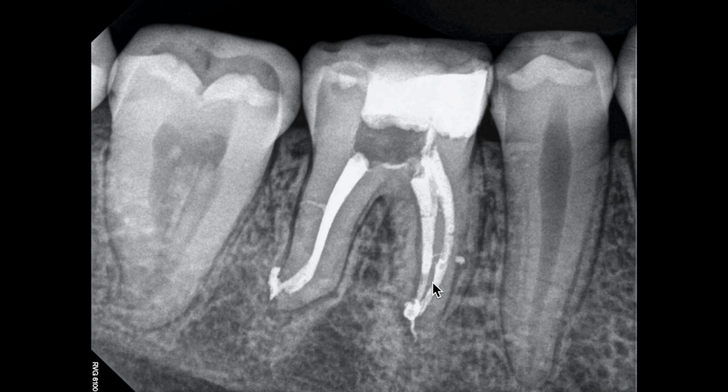So yeah, patency was done, but I had a true stop with a 30 cone. Accessory canal in one or two right here. Little canals where the fin was opened up between, and that was really right underneath the orifice, which is also an interesting comment. And then communication to the periodontal ligament through here, and likely some sort of apical periodontitis going on there. So it made sense why his tooth hurt like a son of a gun to bite on.